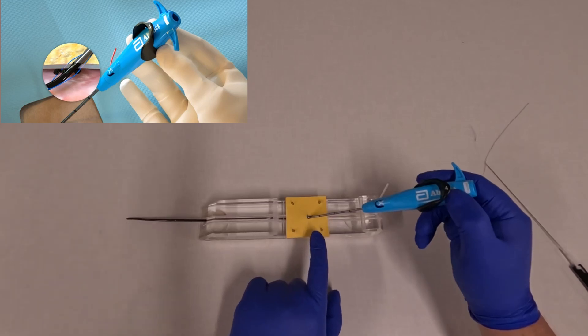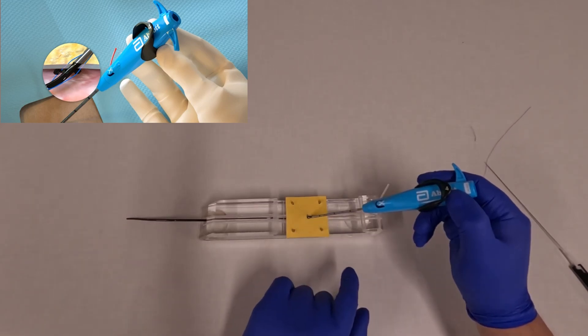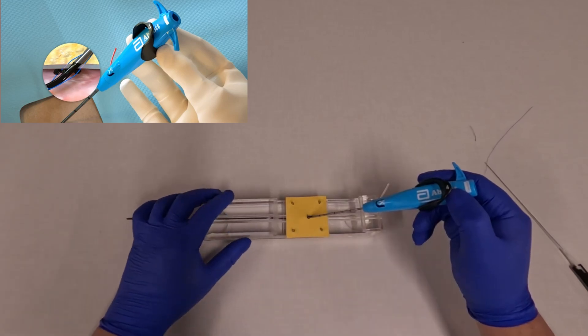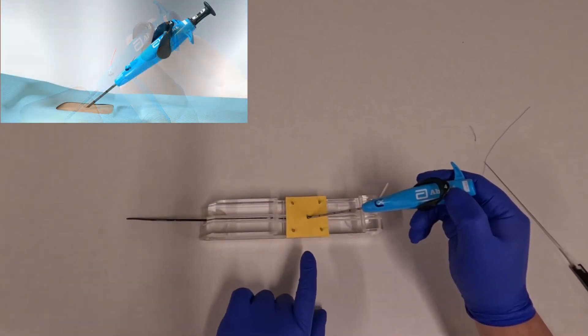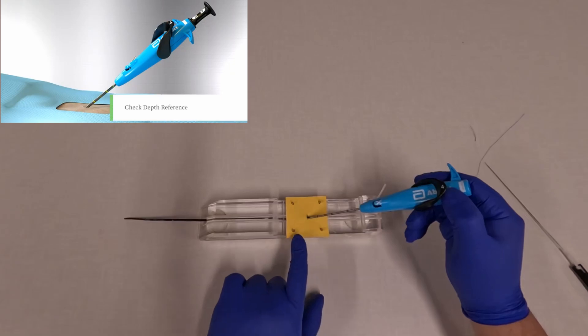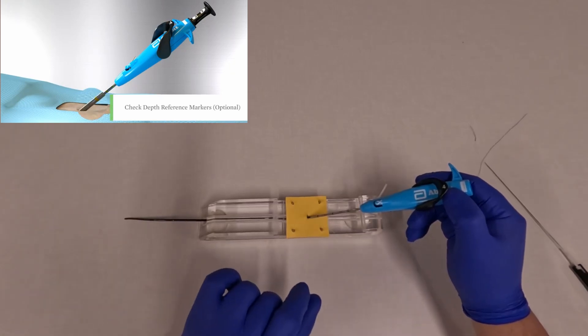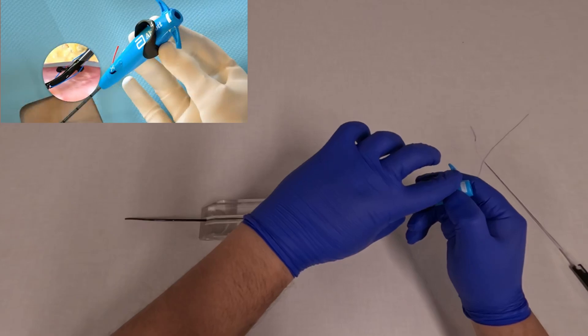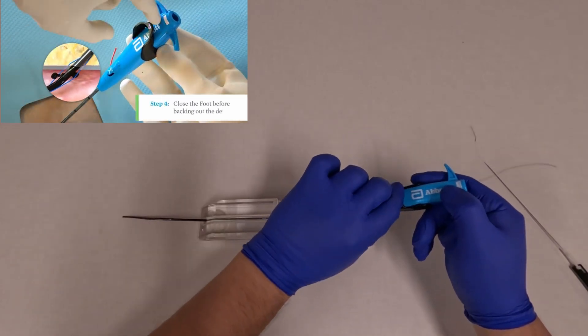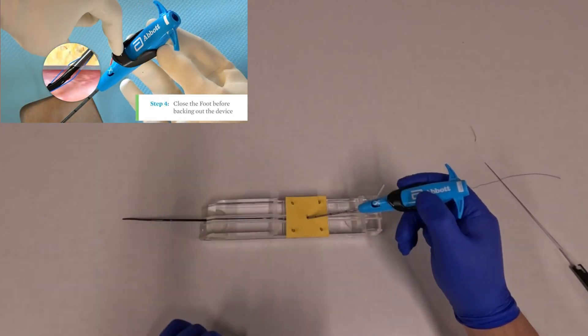At this point, the suture has been deployed. We're going to advance very slightly with the whole device to bring this footplate away from the arteriotomy wall. Now we're ready to collapse the footplate. We deploy step four and the footplate is now collapsed.